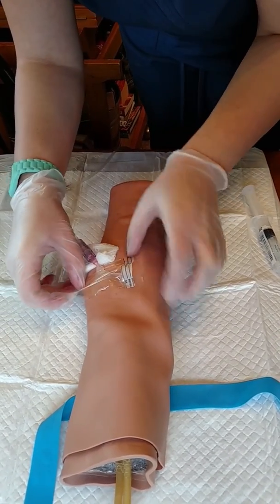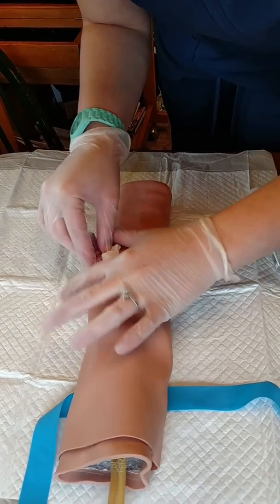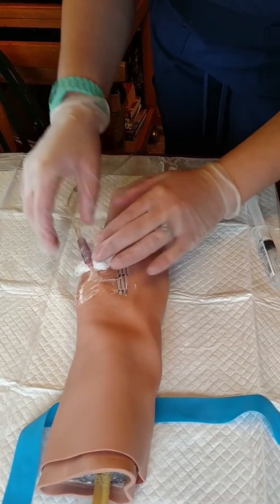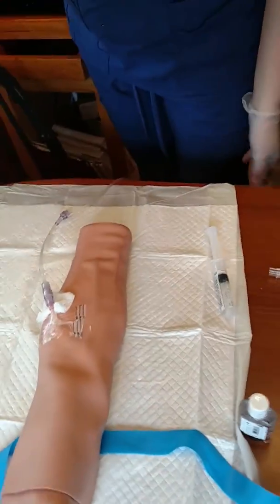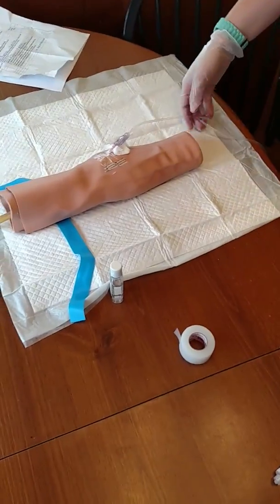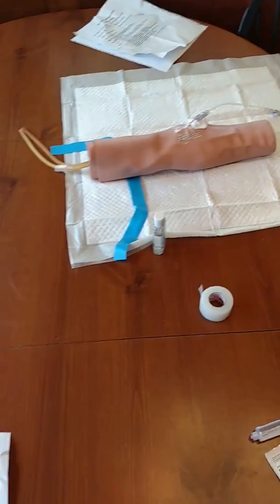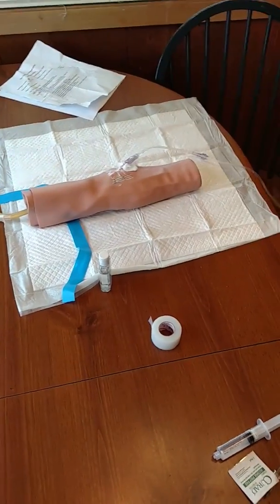Go right over so we are able to see the port and make sure that it doesn't get infected or anything like that. Okay. Alright, so we're all hooked up here now. We're just going to get the IV flowing and make sure that it's to the appropriate drop. Great.